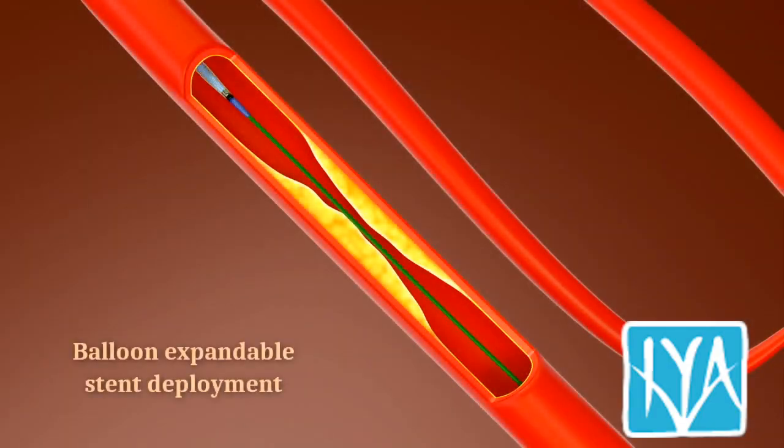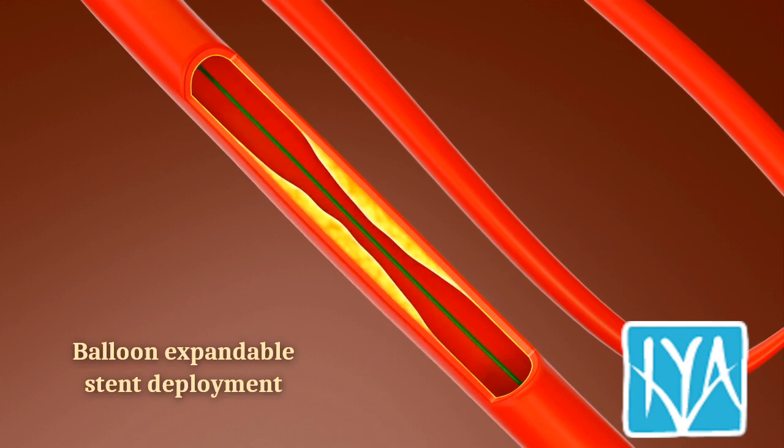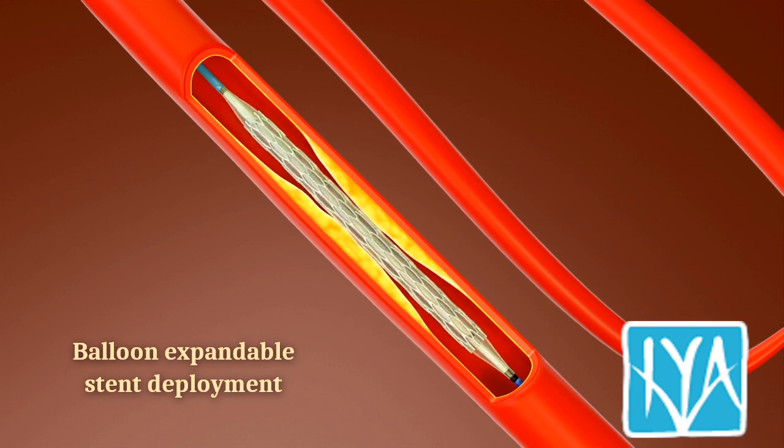Balloon angioplasty with stenting. Depending on the resistance and location of the diseased segment, the vessel may first be treated with a smaller balloon angioplasty, followed by the deployment of a balloon expandable conventional or drug-eluting stent for improved patency for accurate placement of the stent.